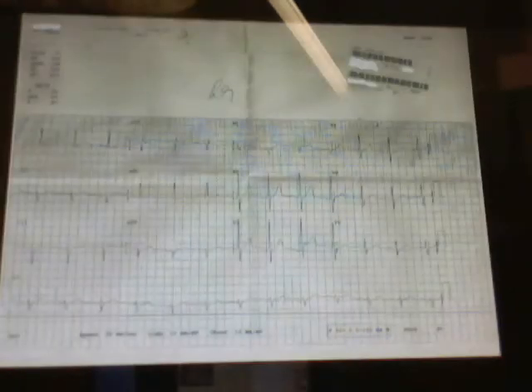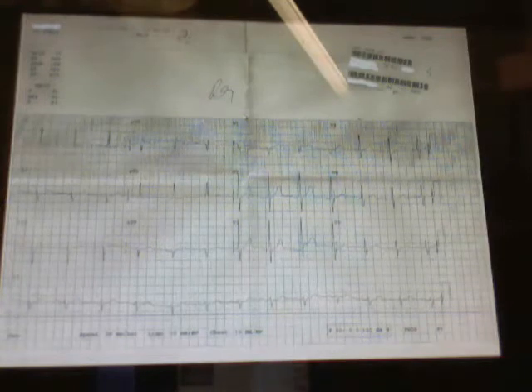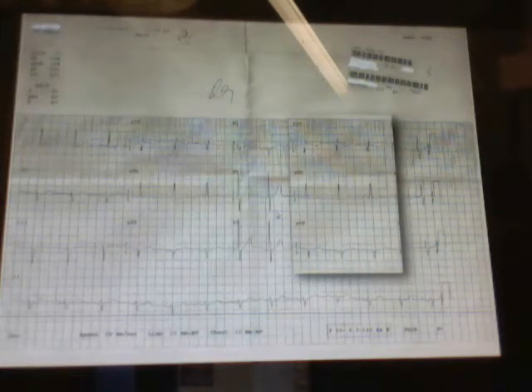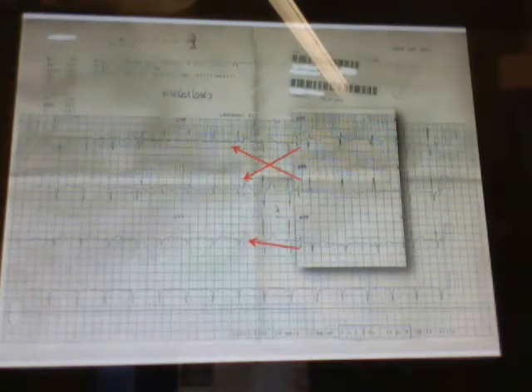So now we look at the first line, our patient first. We have asked the nurses to do a correct ECG. The right arm lead is put at the right arm, and the left arm lead is put at the left arm. We now concentrate on the augmented limb leads first, the AVR, AVL, and AVF. We pick them up and compare with the first line. So look, you can see the AVL channel is actually showing the AVR electrogram, and the AVL electrogram now appears in the AVR channel, and the AVF is still showing the correct AVF electrogram.